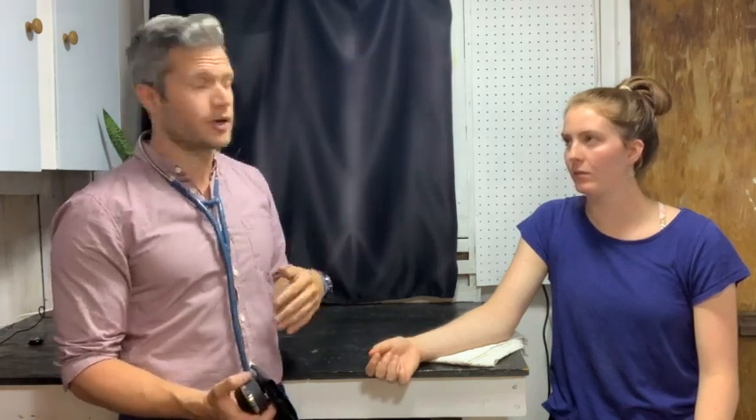This one is actually kind of cool — it's got an arrow for the left and the right arm. Your lab manual is going to give more specific details on how it should be done for your lab activity. Here I have my volunteer Tully, who is resting her arm on a table. If you have a shelf or something, you can use that as well. You just want to make sure the person's arm is comfortable and not highly elevated above their heart — you want to keep it at heart level or even slightly below. Also, before you start your activity, you're going to want to let your person, your volunteer, actually rest for a while. If you dive right into it, just know that you're not going to get a true resting blood pressure — it's going to be potentially a little bit more elevated. And if someone is borderline hypertensive above the blood pressure cutoff for exercise, you might want to retest and make sure that you give them a long enough break.